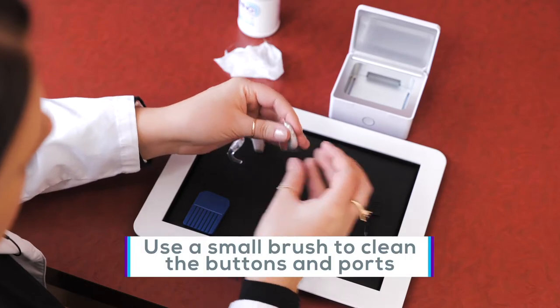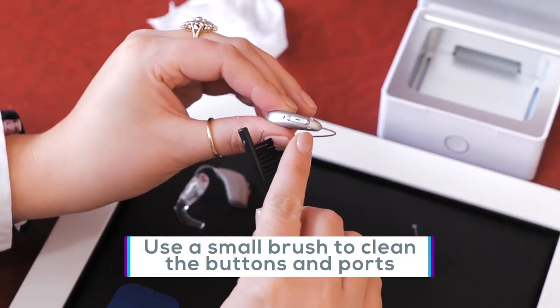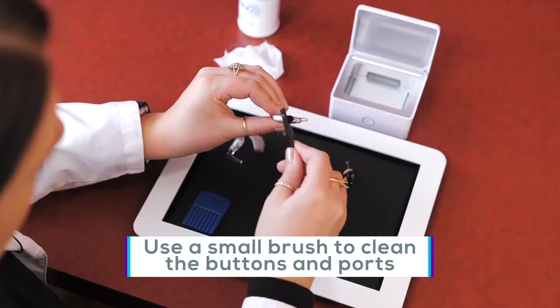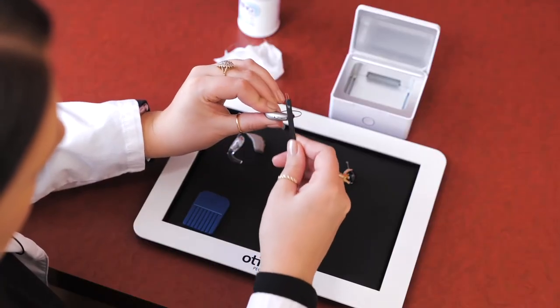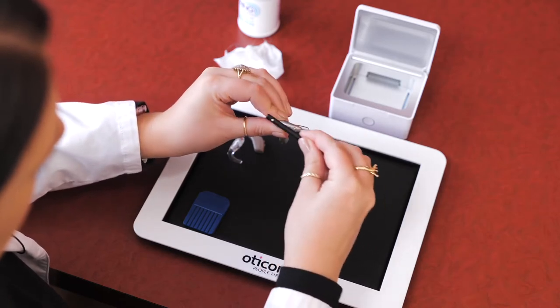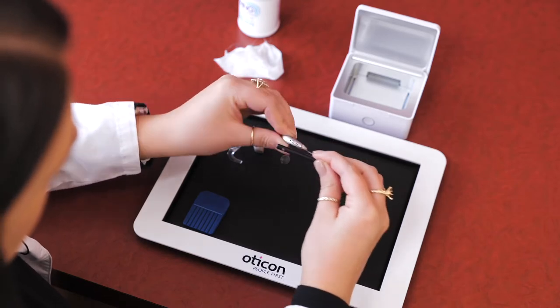we want to take a brush and gently go around the buttons, toggle switch, and the microphone ports. If you don't have a small brush, you could even use a soft bristle toothbrush. Dust, skin cells, and other debris can get trapped in these smaller areas and make it harder for the hearing aid to get the sound to your ear or just keep it from working properly.